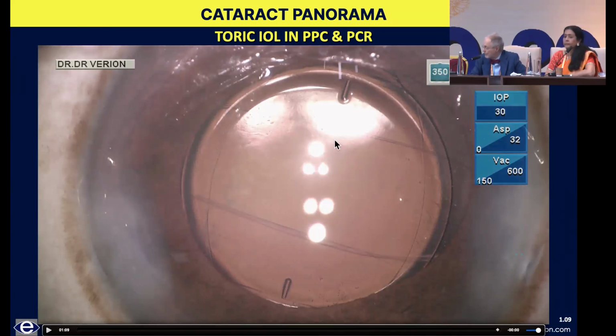David, what do you say? Well, I wouldn't do it myself. If I had an intact rhexis, you have a choice of reverse or regular optic capture. And if I were the patient, knowing what I know, I'd choose the reverse optic capture. That's not to say for sure you'd get into trouble the other way, but I think there's a lot more track record that way.